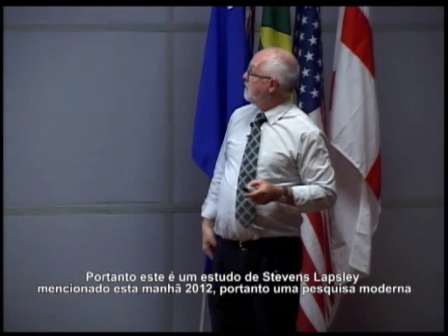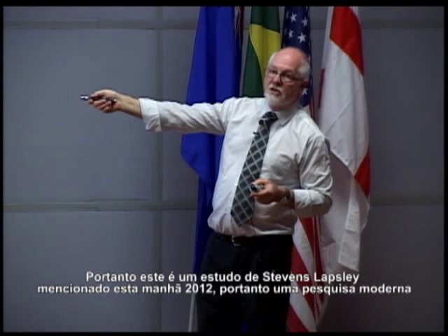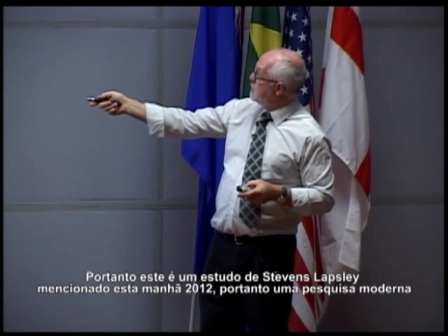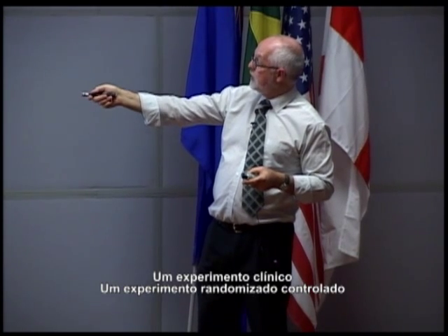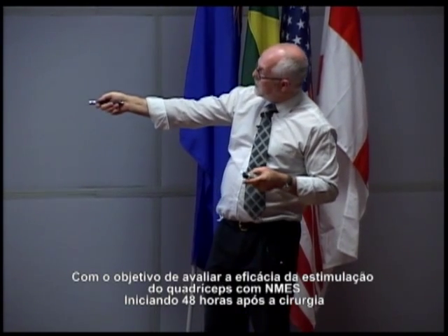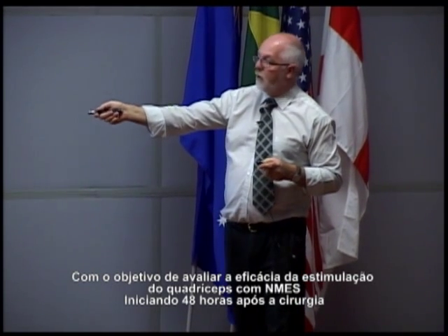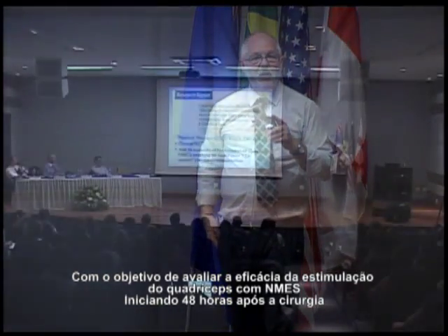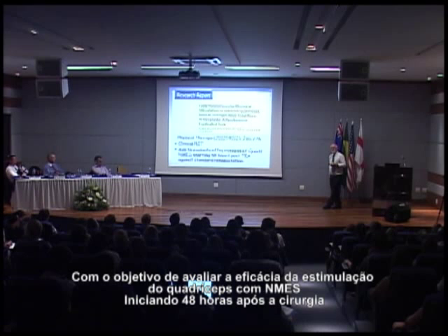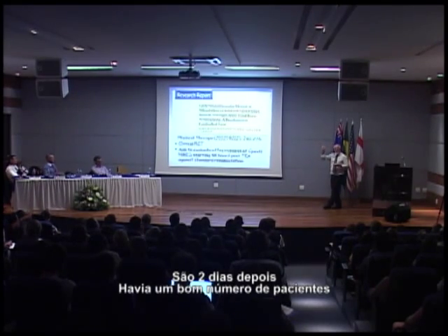study by Stevens Lapsley that got mentioned this morning. This is 2012, so it's a modern research paper. It's a clinical trial, randomized controlled trial, and it aimed to evaluate the effectiveness of stimulating the quads with NMES starting 48 hours after the surgery. So this is not 3 weeks later, 6 weeks later. This is 2 days post-op.